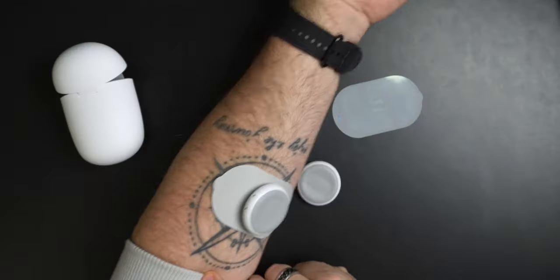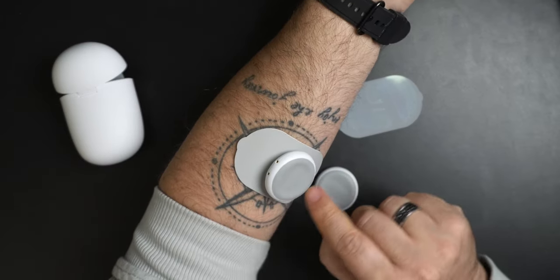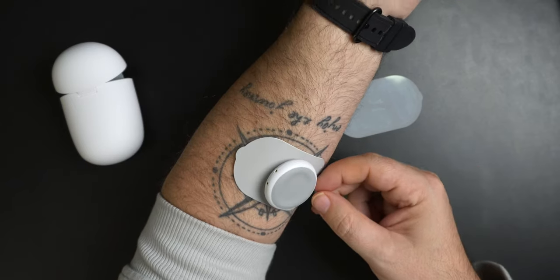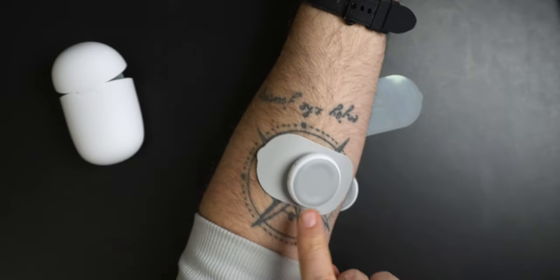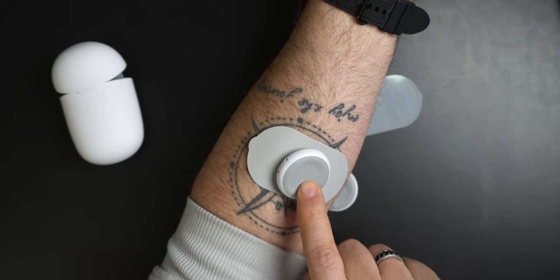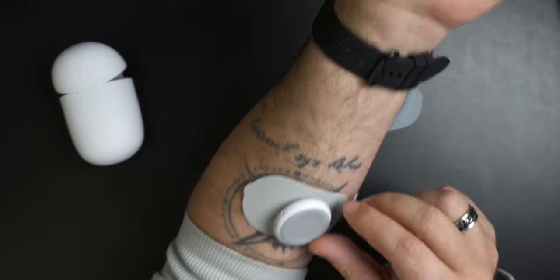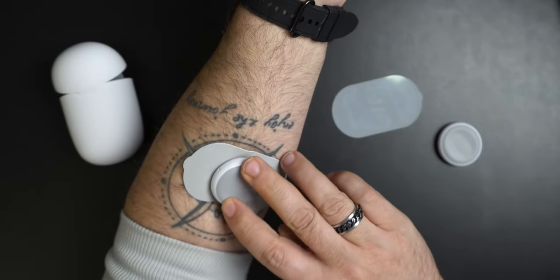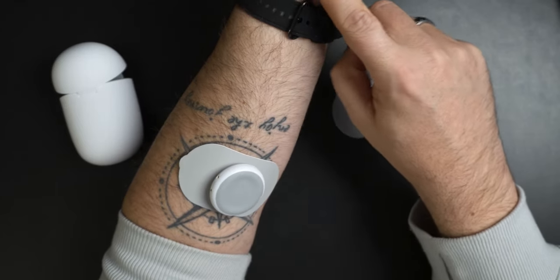Okay, so let's put it on my arm. I'm going to put it right here, right on the old spot. Okay. And you guys can see it. I think I'm on power. I think that's power. No, power's down here. Sorry, power. There it is. So there is a little light there, you guys may not be able to see it, and then you can click to go to mode. And if I turn this one so I can see what it says, this is power mode, which means this would be positives on this side. Oh yeah. Well, that's got a good feel. You guys can't tell, but I can feel it all the way up to my wrist.